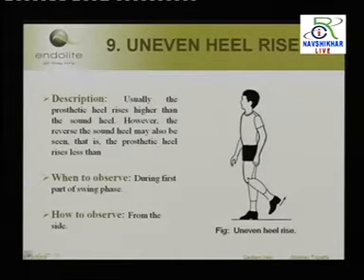like we have door closers. We push the door, it comes back automatically and closes. If he doesn't have any swing phase device, he has to wait for the swing to come forward because of the momentum. This is one of the major observations seen on patients using an artificial system without any friction or swing phase device. He'll have to wait for the swing to come forward, which will reduce his speed of walking. So it goes up, he waits for the heel strike to come forward, again it goes up, he waits.